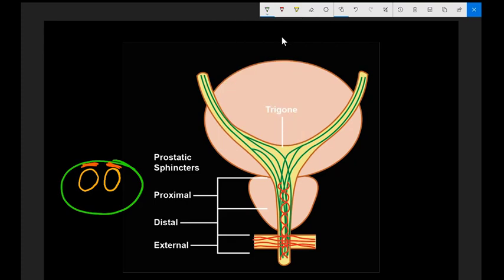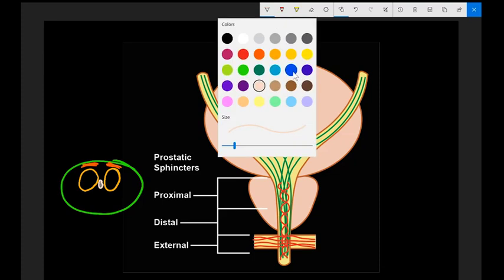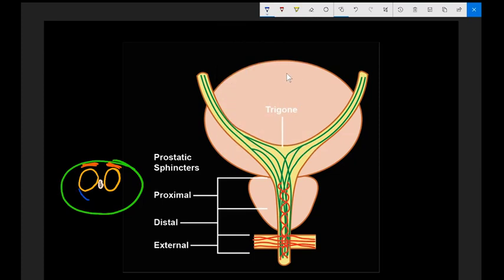We'll make that gray, kind of smack dab in the middle there. And we'll even draw in the periurethral tissue just for giggles. Here's some periurethral tissue right here. And then behind that, we're going to have in blue the central zone. And it kind of looks a little bit lobular, and the central zone and TZ make up the central gland, and they will progressively enlarge as you get a little bit older. And then everything else around the outside is going to be the PZ. So we're going to have right PZA, PZP, PZM in the back, and left the same thing. So that's your base appearance.